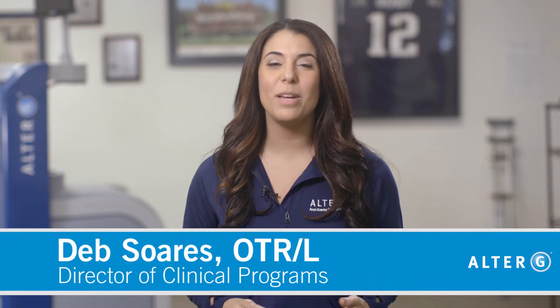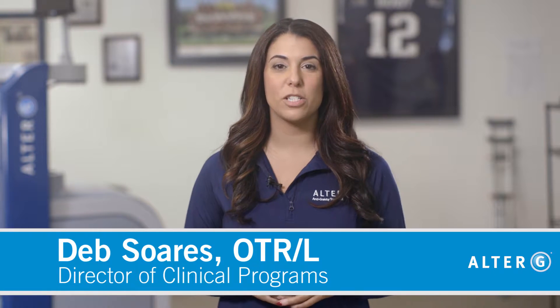The video monitoring system is a great way to provide valuable feedback to your patients when using the AlterG for gait training. In this video, we'll go over some tips to help maximize its benefits.